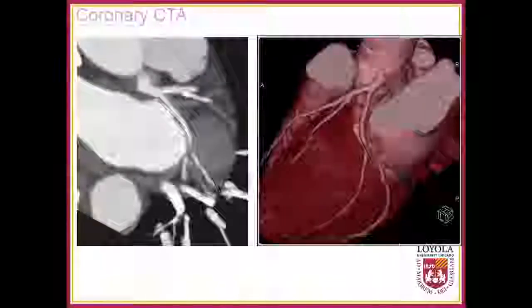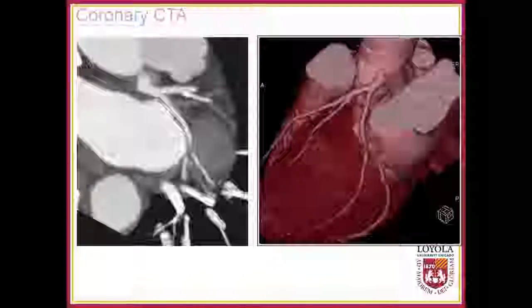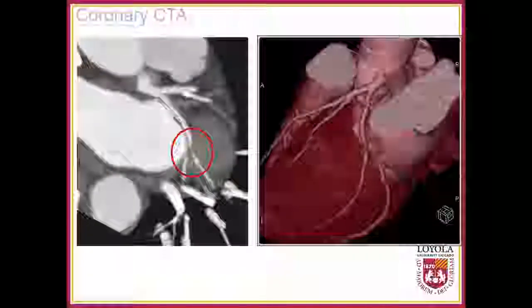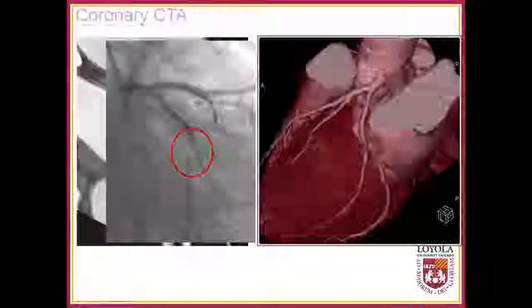Any takers? So there's a stenosis at the bifurcation of the circ-OM system right here. And you can appreciate that on the 3D volume rendered image here. And the patient underwent a cath demonstrating and corroborating that bifurcation lesion at the circ-OM system.